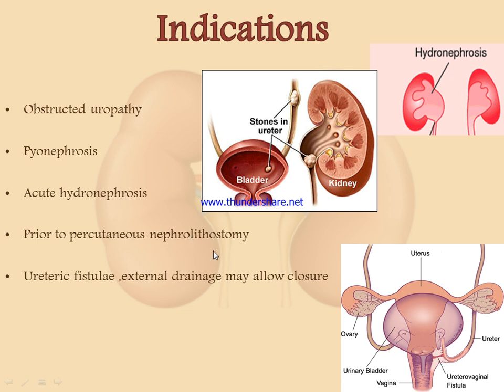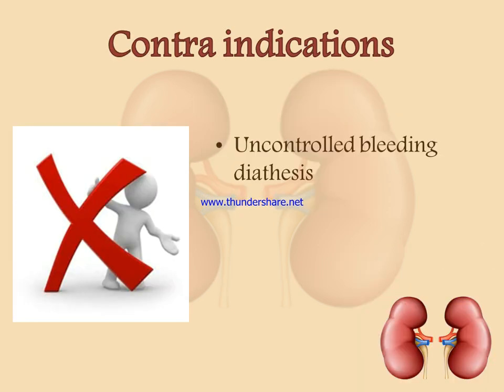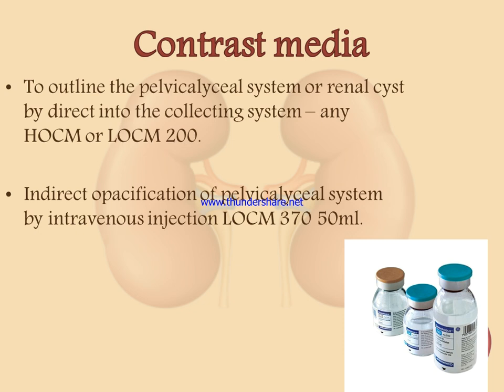It is also done prior to any percutaneous nephrolithotomy procedure, or for any suspected ureteric fistula, where external drainage may allow closure. In case of contraindications, such as any uncontrolled bleeding or diathesis, we don't do this procedure.